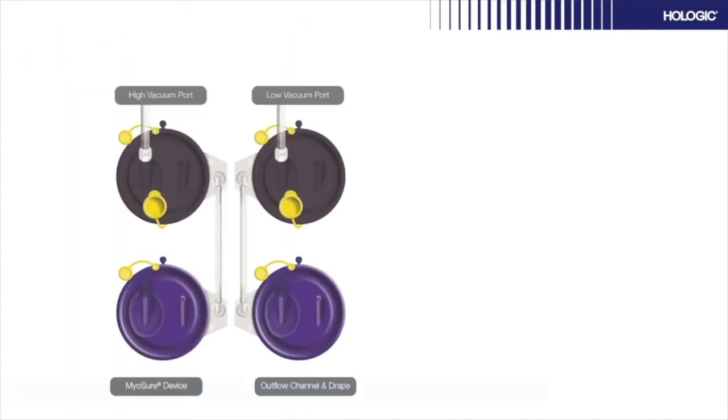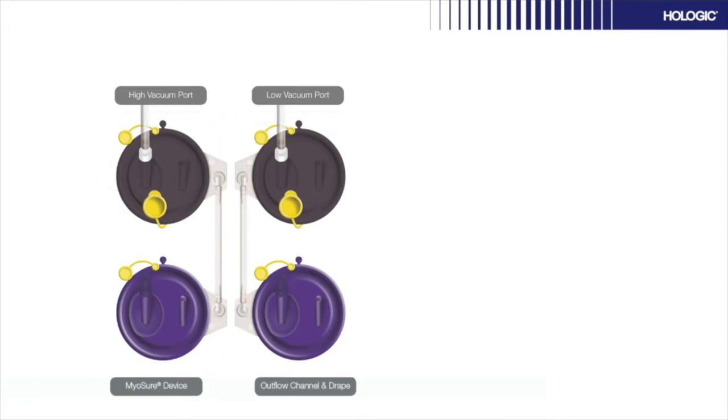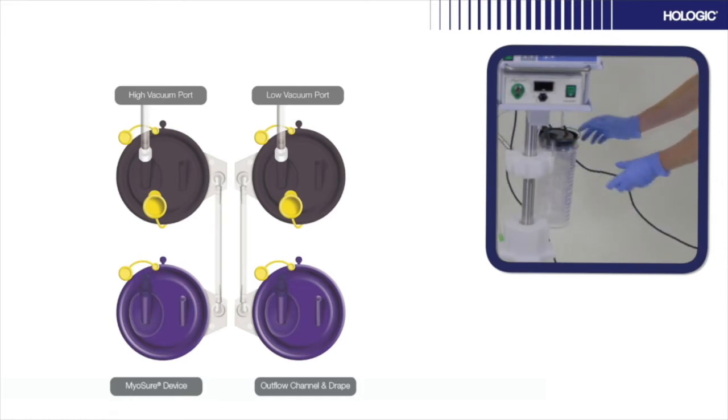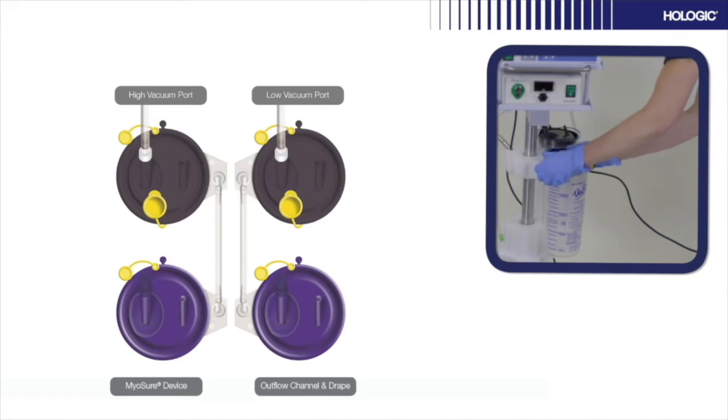There are two sides to set up which work independently. The right side of the cart is for the outflow diagnostic setup, and the left side is for the operative MyoSure procedure. Hang the canisters onto the cart. Caution, do not use excessive force when placing the canisters onto the cart to avoid damage.